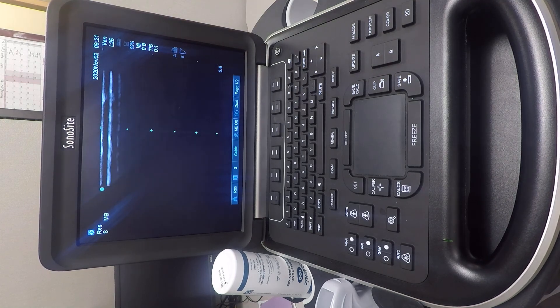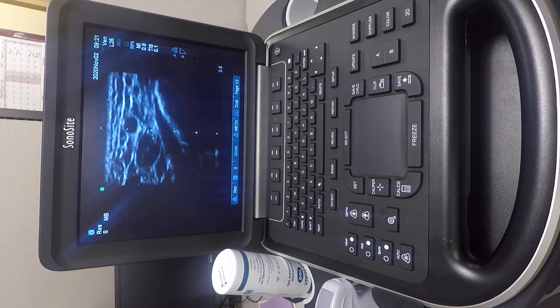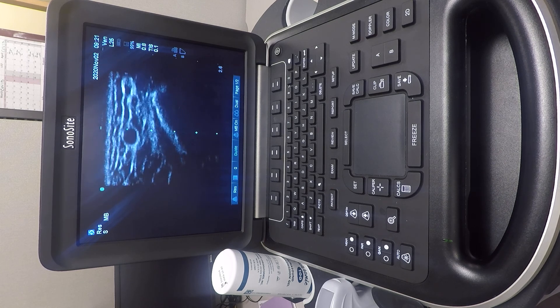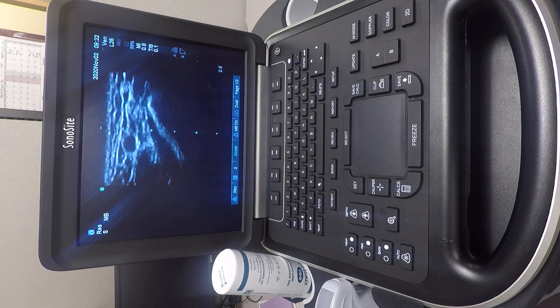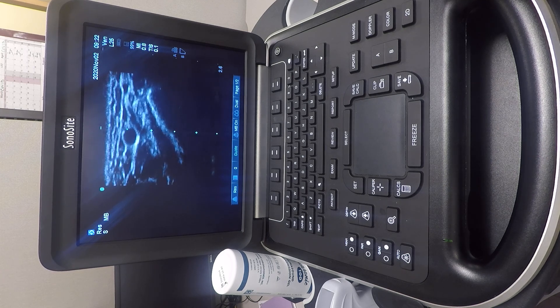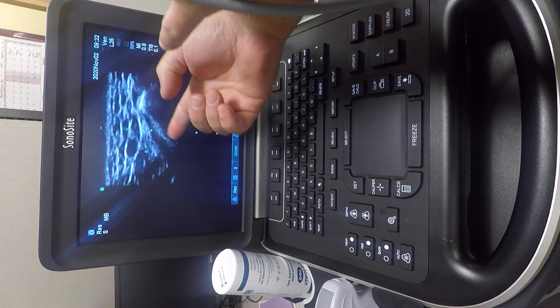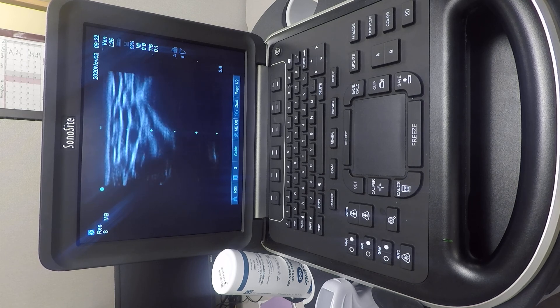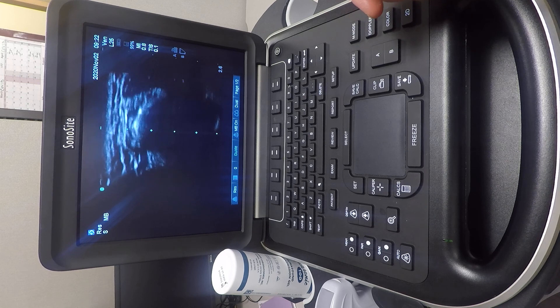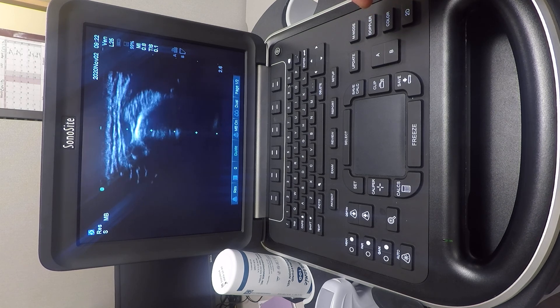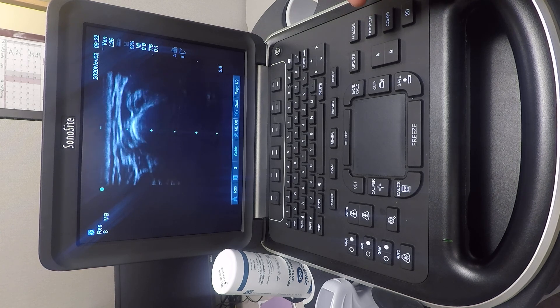Arteries and veins identified. Next, we need to identify bone. Bone is very dense — you should see this line here; that's your radial bone. There's nothing below it on the image. If you continue along and rotate your wrist to the outer edge, you can see the radial bone goes all the way around.